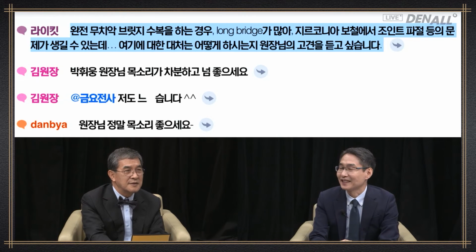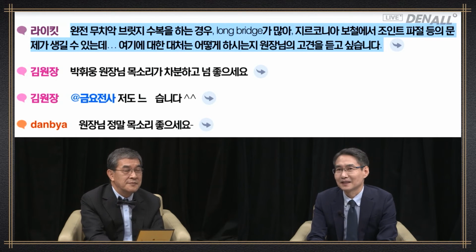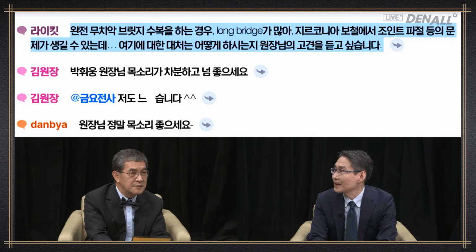In the case I've shown you, I've placed the 4 implants to restore 12 teeth. And as I did it, I knew that fracture could occur and I took caution. And there are cases where restorations have been provided again after joint fracture. Zirconia is an excellent material, but there's a danger of fracture and chipping.